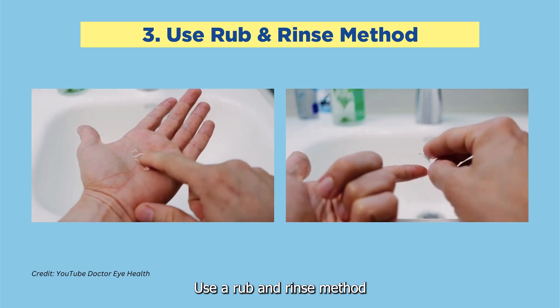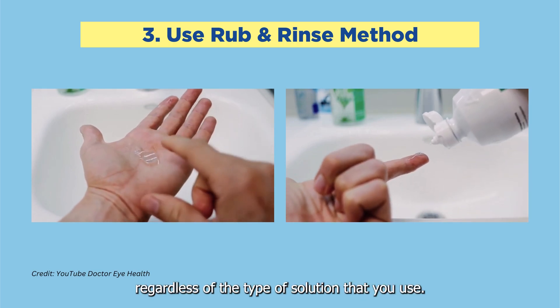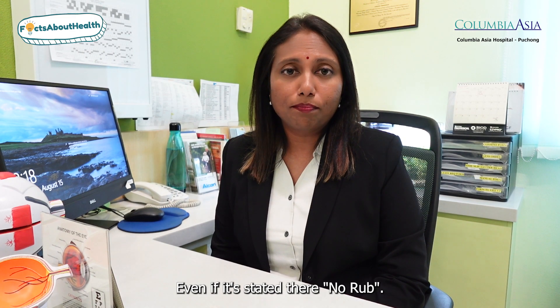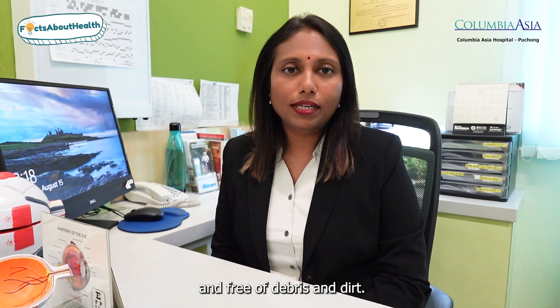use a rub and rinse method to clean your lenses regardless of the type of solution that you use, even if it is stated there — no rub. This is to ensure that your lens is clean and free of debris and dirt.